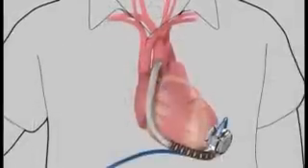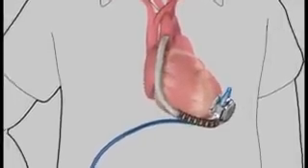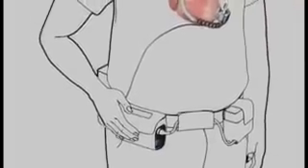The driveline cable, constructed with fatigue-resistant conductor wires similar to those used in pacemakers, exits the skin and connects the implanted pump to an externally worn controller.